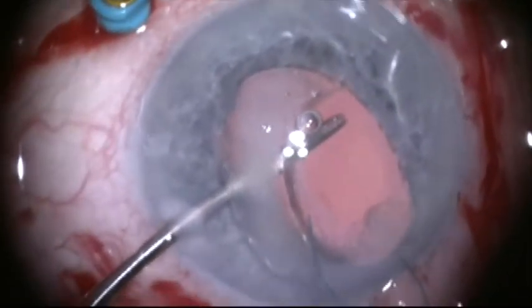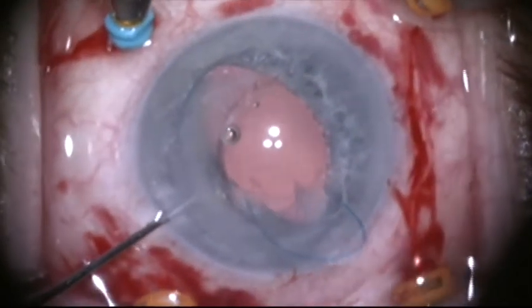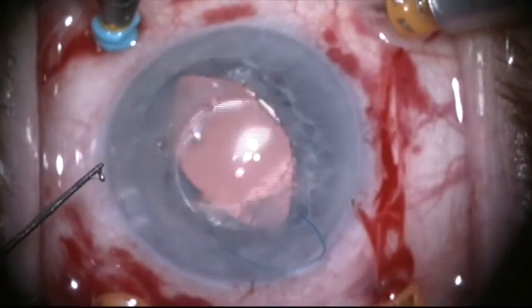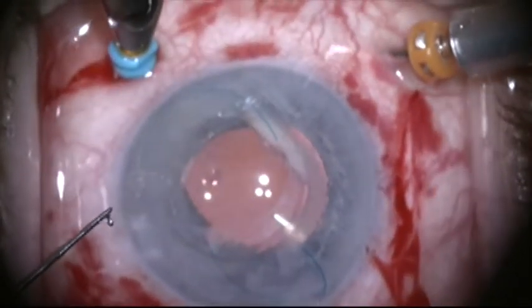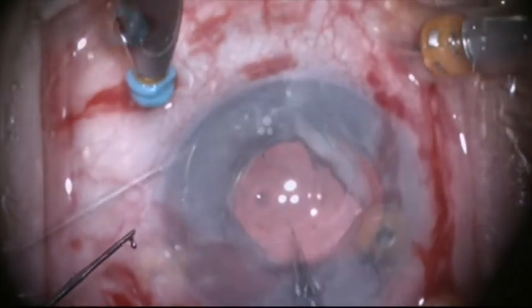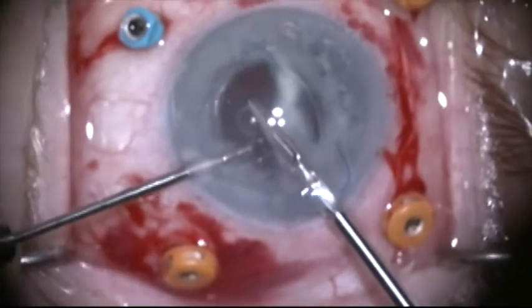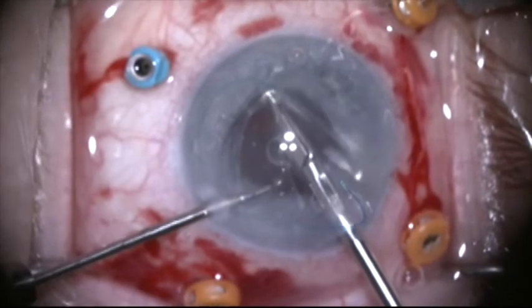I'm going to pull the haptic out of the eye — now I've really got the implant secured. I'm going to go through the pars plana with a cyclo-dialysis spatula and push the lens up through the pupil, which doesn't dilate that well as this patient has pseudo-exfoliation. There is dispersive viscoelastic in the anterior chamber to protect the cornea endothelium. Once the lens is securely in the anterior chamber, I'm going to cut it about 90% of the way through.